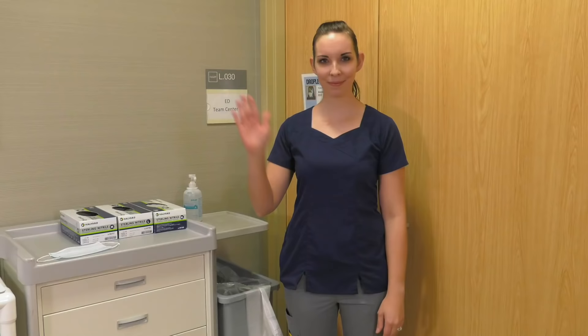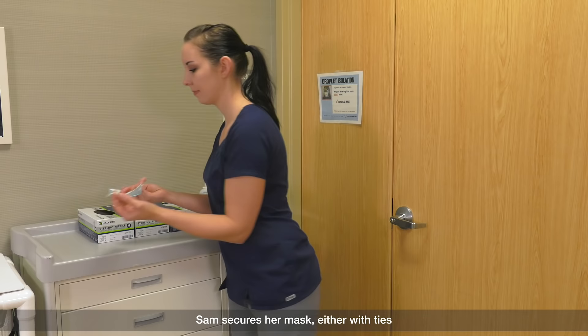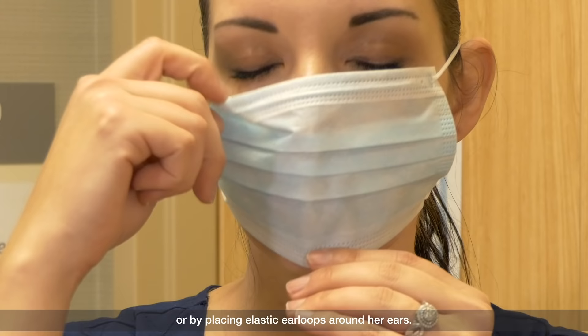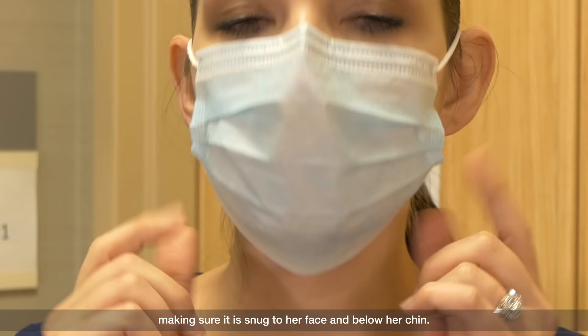Sam performs hand hygiene. Sam secures her mask either with ties or by placing elastic ear loops around her ears. She fits the flexible band to her nose bridge, making sure it is snug to her face and below her chin.